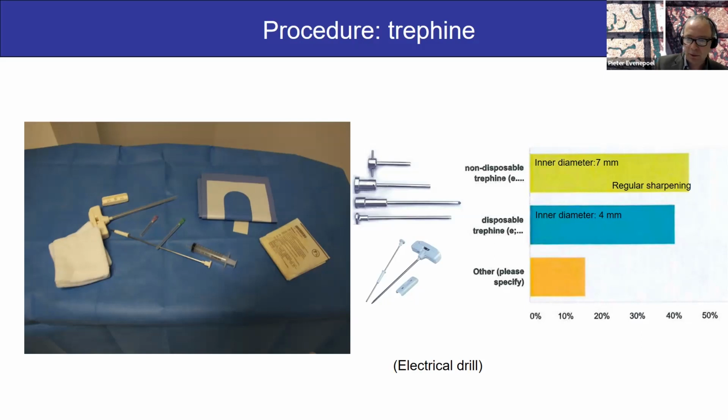The bone biopsy can be performed in an outpatient setting. You can see how the table is prepared. We need some kind of anesthesia. We need the needle. We have gloves. We have sterile material to proceed with the bone biopsy.